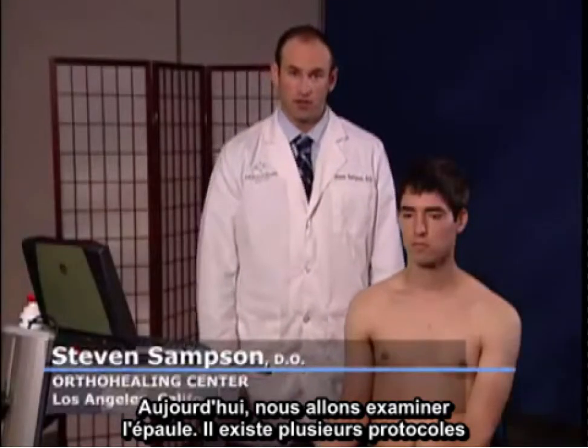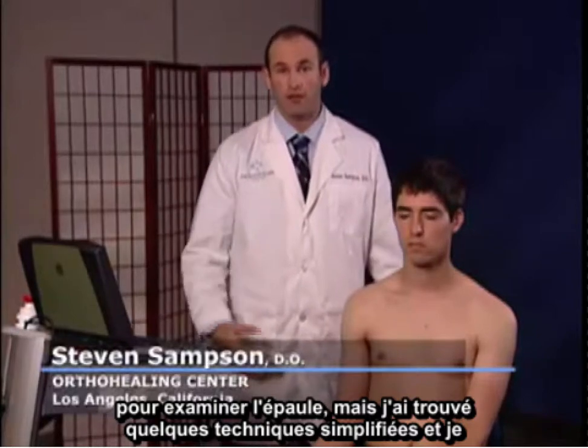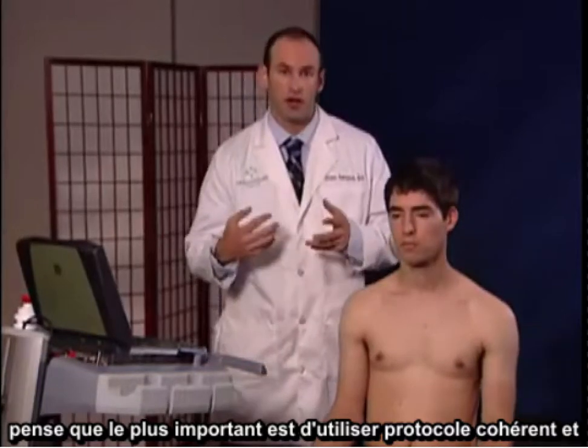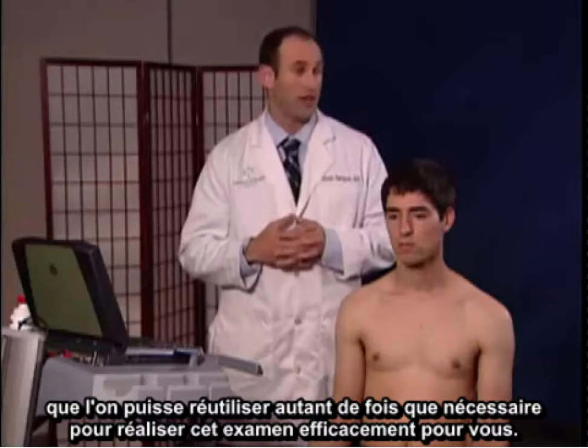Today we're going to examine the shoulder. There are multiple protocols available for the shoulder, however I've found some simplified techniques and I think what's most important is to maintain a consistent protocol and repetitively go over it until you're comfortable with what exam works for you.